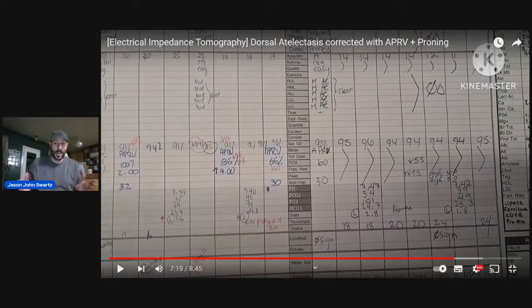Where the lung is going to get hurt is when the lung is in transit, when the lung is moving. So if there's anything that I can do that will minimize the chest movement, then I think it's worthwhile, because it's during the chest movement that you might possibly have areas that are not perfect.